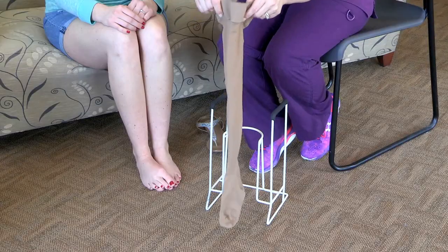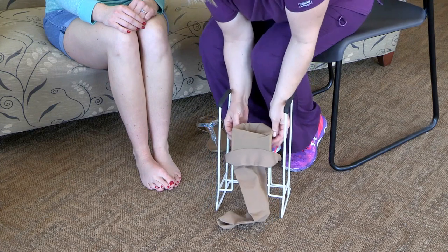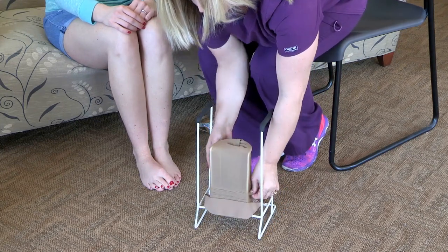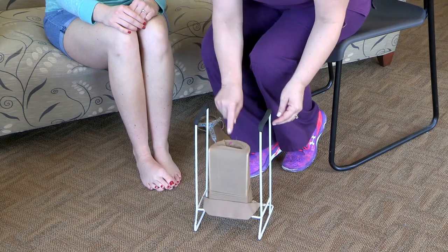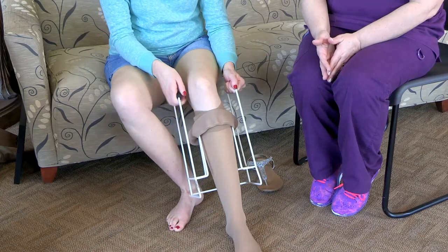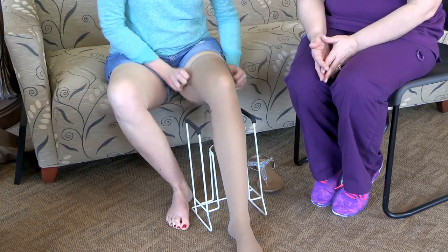Sometimes you might have a closed-toe stocking, and closed-toe stockings have the limitation that you can't use a bootie because the toe is seam shut. There are other assistive devices, one of which is called a butler. A butler is a frame designed to help you get the stocking on, and it's especially helpful if you struggle to bend over and reach your foot. Shannon takes the stocking as if putting it on her leg — heel pointed toward her, toes away — and wraps the top of the stocking over the frame, pushing down until she reaches the heel, where you can see the seam and emblem of the stocking. Then you stick your foot inside, pull it up to the top of your calf, grab the top of the stocking, and pull it up your thigh. It's that simple.